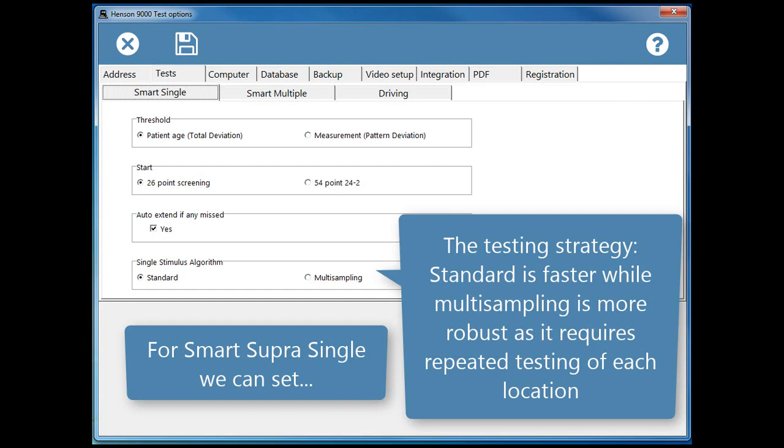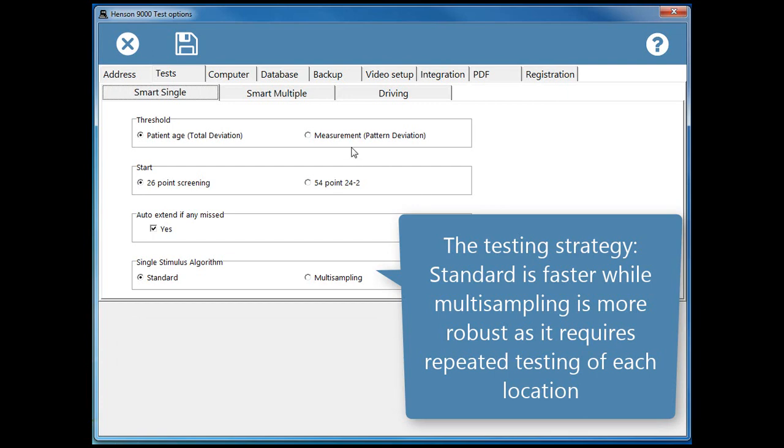And the Testing strategy: standard is faster, while multi-sampling is more robust as it requires repeated testing of each location.